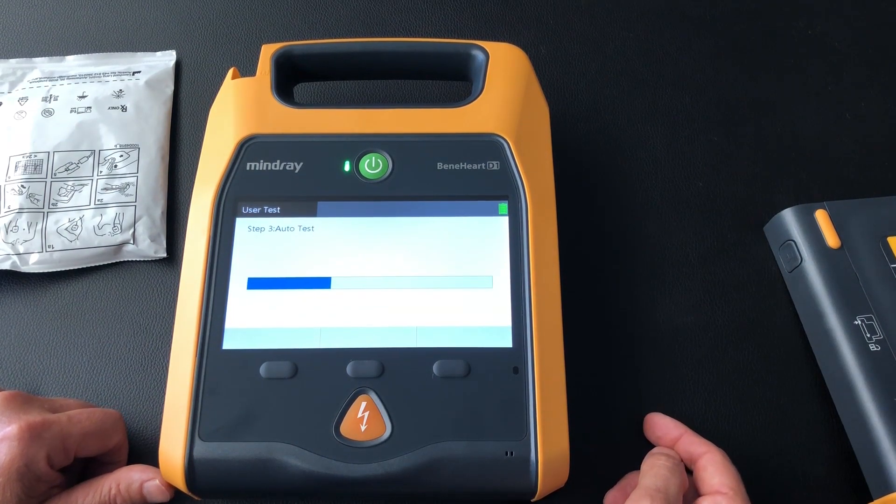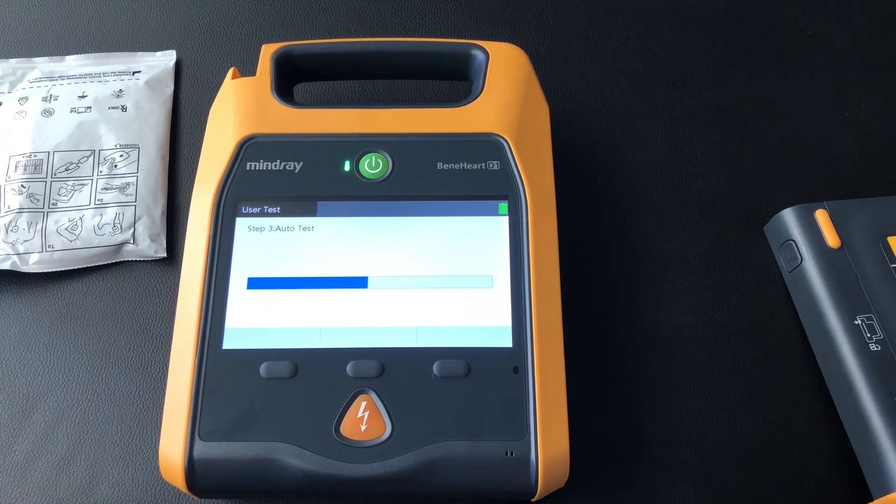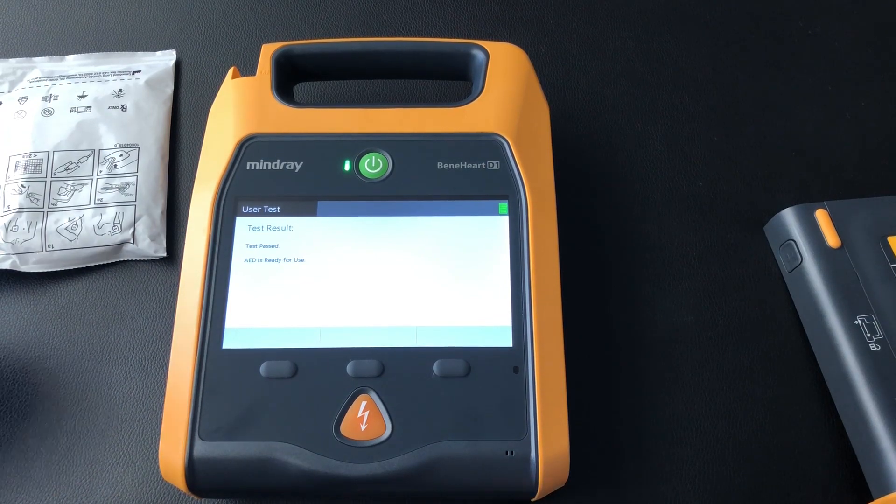Now just quickly, it tests itself — takes a few moments, makes a few clicking sounds. Okay, all good. Test passed — AED is ready for use.